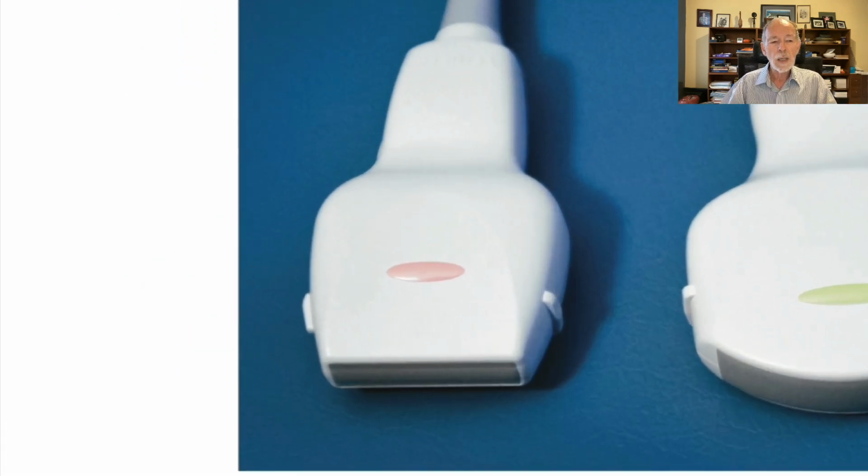Linear probes are particularly well suited for areas where the skin surface is relatively flat and where it's not possible to push the probe in very much. So they are typically used on the limbs, for example, for vascular ultrasound, for musculoskeletal ultrasound, and areas like that, where you are, as I said, placing the probe on a limb.